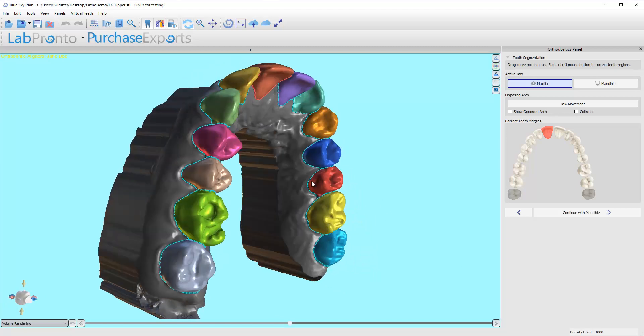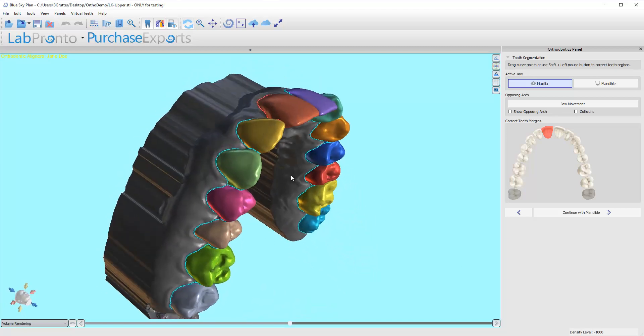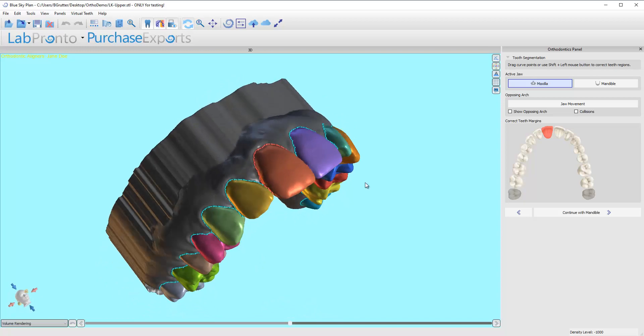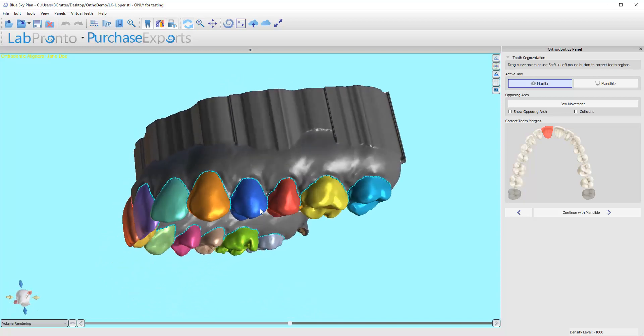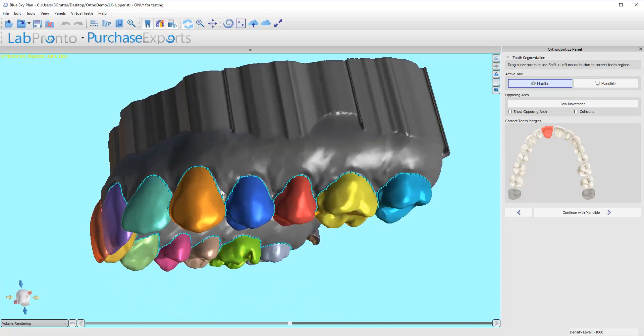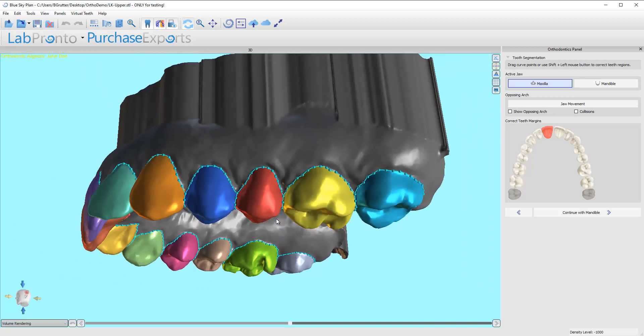At this point the software has segmented out each tooth, tried to make its own unique tooth surface. And depending on how well you're scanning, how good you're getting defined embrasures here, the better the software is going to do.